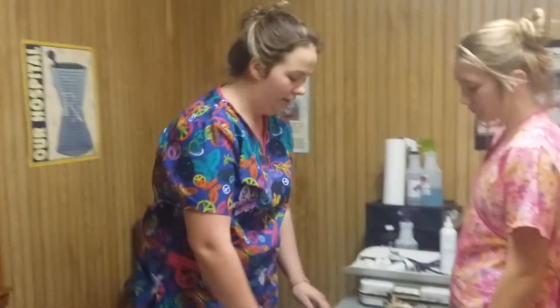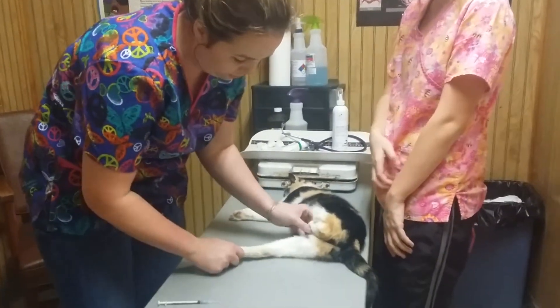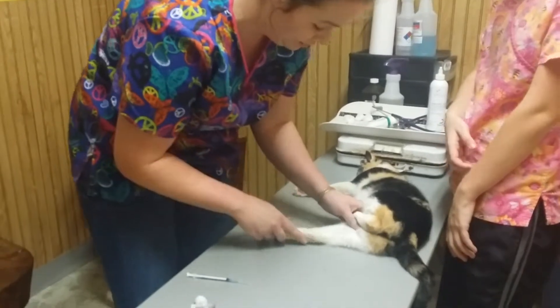My name is Haley Togo and I will be performing a medial saphenous venipuncture on a cat. This is Meow Meow and she is sedated right now.